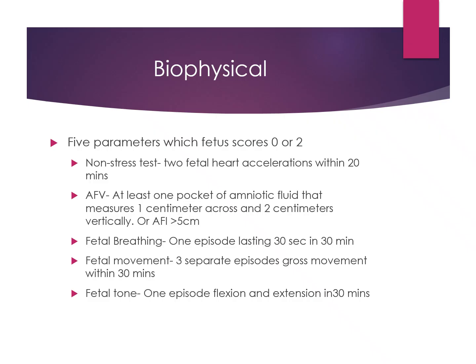All right, so that is the biophysical profile. That is what we're looking for in the third trimester, what we need to include in our protocols. Remember, we're going to be using a curvilinear, the highest frequency probe that we can use without losing our image, not having our resolution. That's the word I was looking for. Having our resolution good, we want to have the highest frequency with our depth.